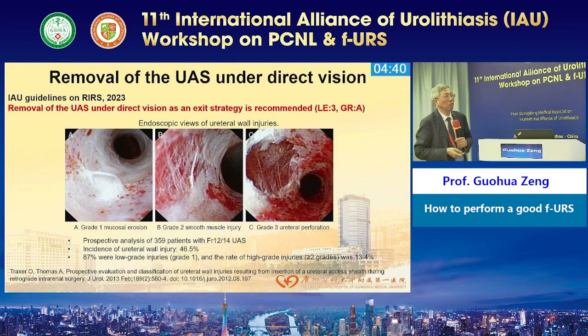And how to remove the sheath, you must use an endoscopy way. This is what the guideline recommends, because according to Oliver's publication, for 12 and 14 sheaths, the ureteric injury is up to 46.5%, which is too high. You must check it. You must check it.